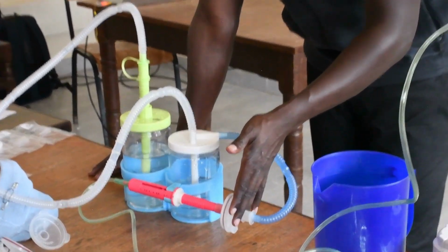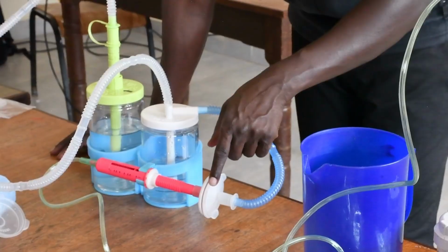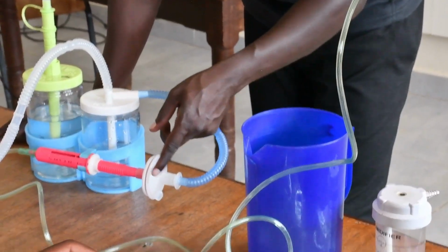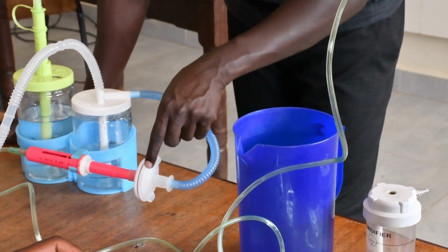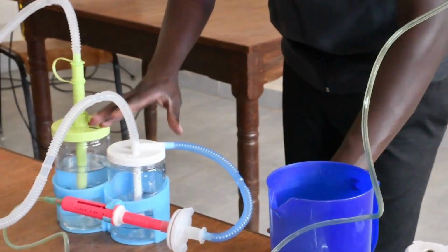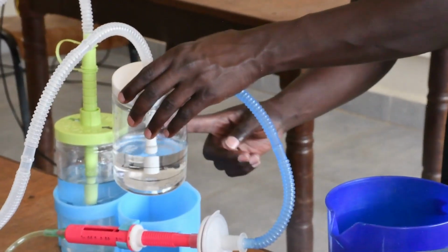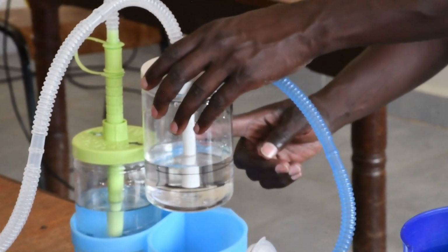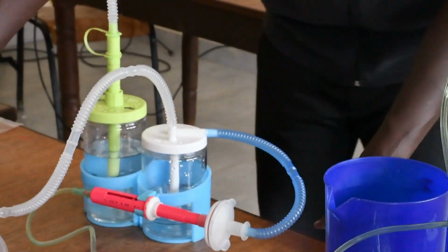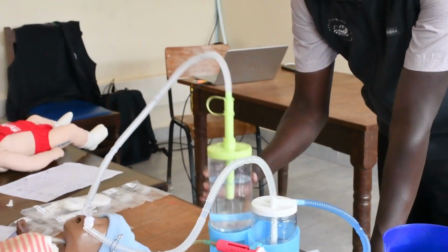Then from the blender it comes to the filter. So monitoring the filter is making sure that you change your filter every 24 hours, or when you change from patient to patient, or when you see the filter is discolored, it has changed color. So remove the filter and put a new one. Then continue following with the humidifier. What do we monitor in the humidifier? Making sure our humidifier is filled up to the fill line. So the water levels are good. Then it goes to the patient. So before you do patient monitoring, come back again to the device. So what should you monitor here?